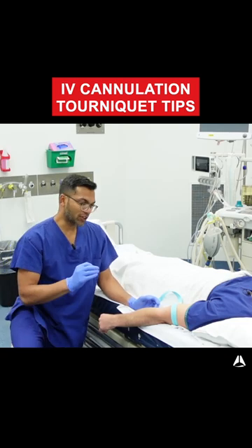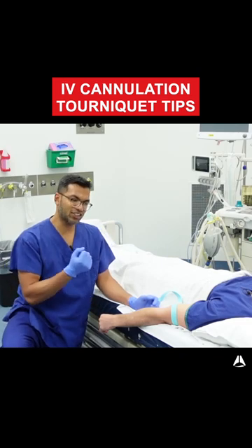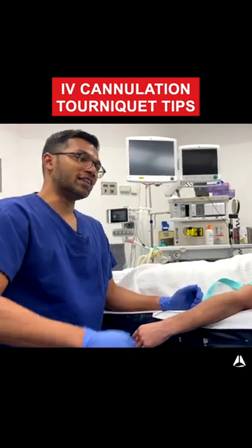If you really want to make sure you're getting absolutely the perfect amount of pressure, you can use a blood pressure cuff. Inflate it to just below arterial diastolic pressure — that way you ensure maximum arterial inflow while limiting venous backflow.